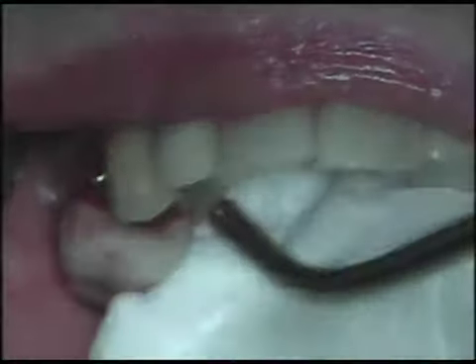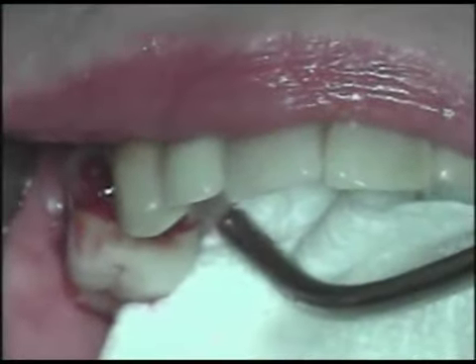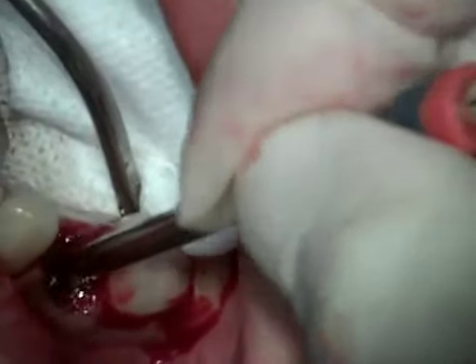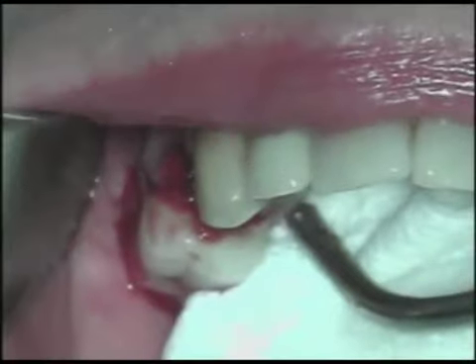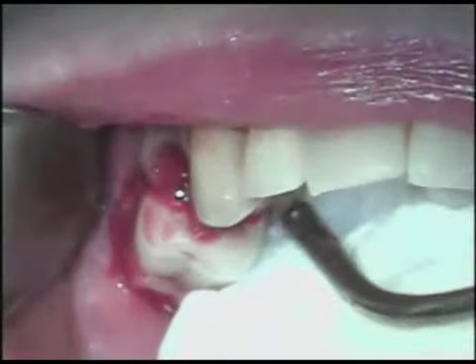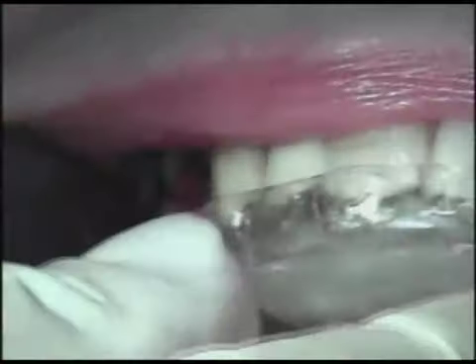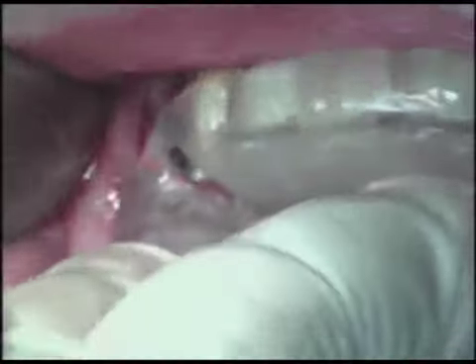What this does is give a little puff of bone that's going to be pushed up by the implant into the sinus floor to give a little extra cushion there, and also it's going to fill the gap between the implant and the alveolar wall. So now we're going to put the surgical template back in the patient's mouth, put it back into position and stabilize it.